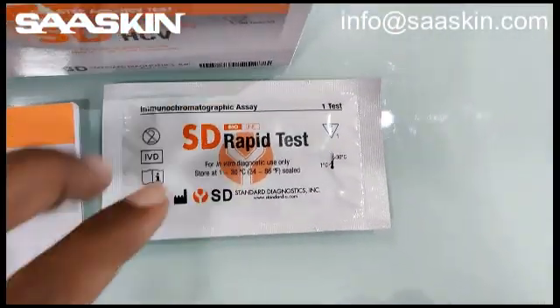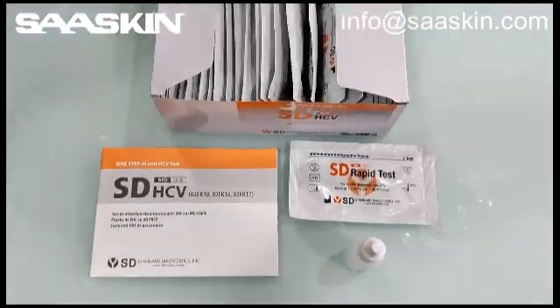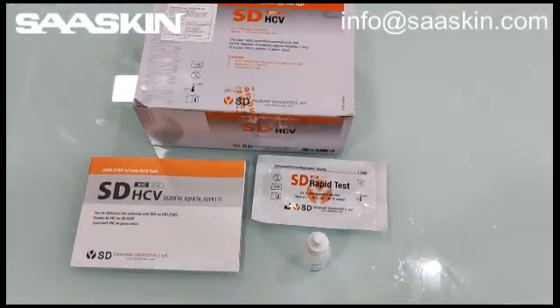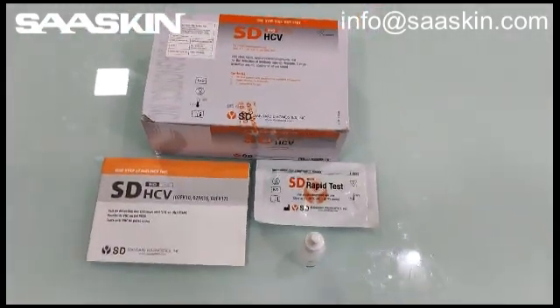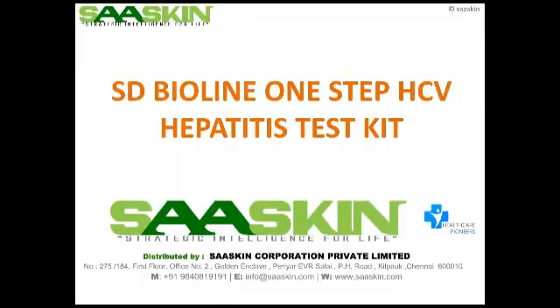Just quickly to recap, the SD HCV Antibody Test Kit contains a booklet, 30 test cassettes, and one buffer solution. Here is a complete introduction about the kit. Thank you.